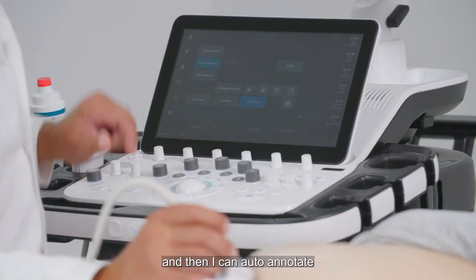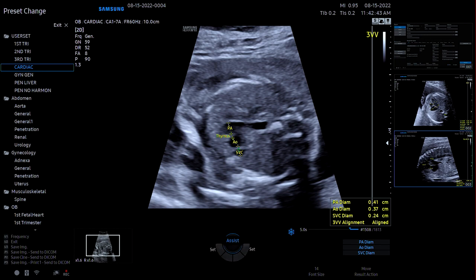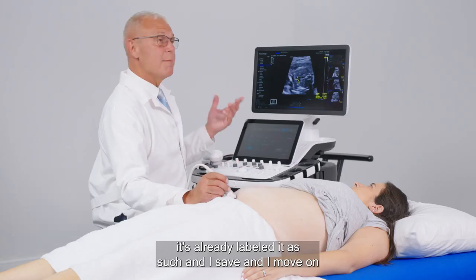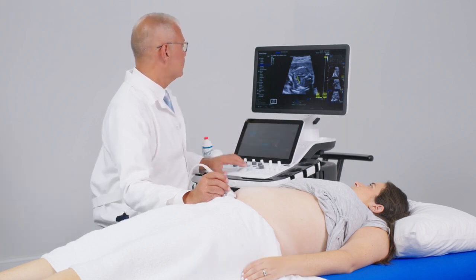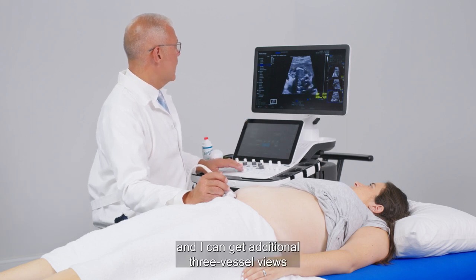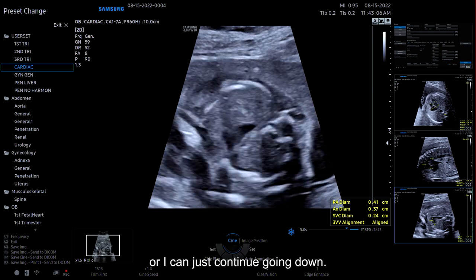And then I can auto annotate, and it'll automatically label as well as measure my 3-vessel view. And you can see on the top right-hand corner of the screen, it's already labeled as such. And I save and I move on to my next. Now, utilizing that same cine loop, I keep on scrolling down, and I can get additional 3-vessel views, or I can just continue going down.